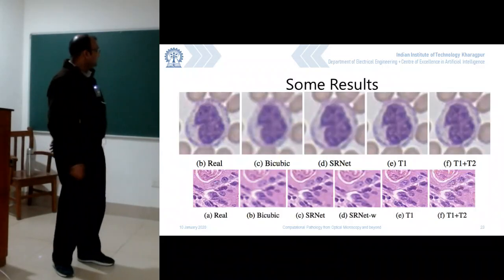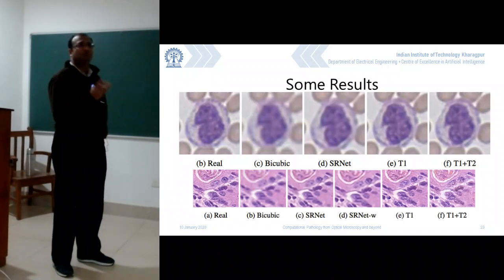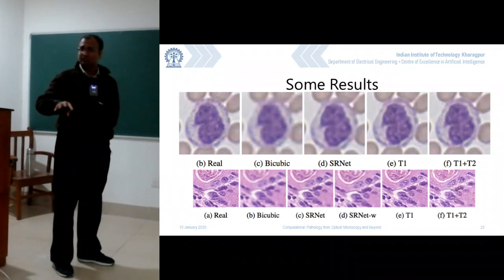So look at a sample over here. The projection is already bad, but still you can make out, here at least, you can see some granules and some points, whereas this is a simple bicubic interpolation. You see it's very cloudy and almost washed off.